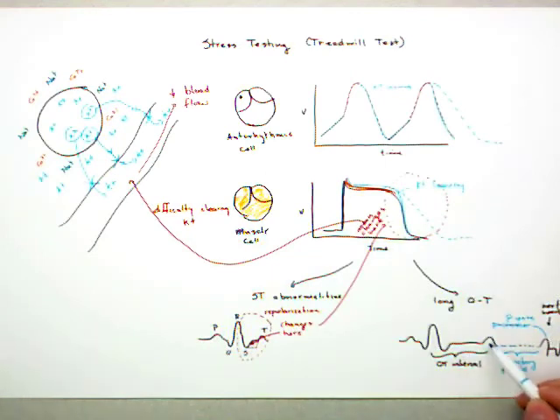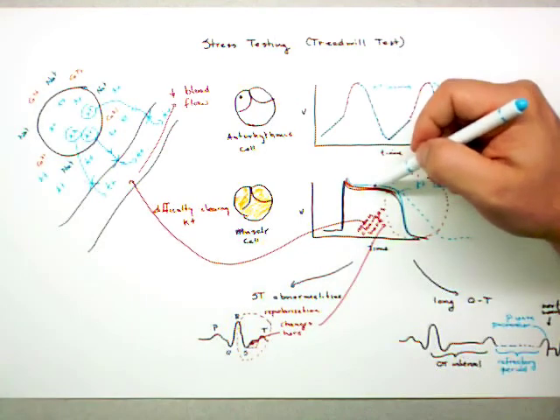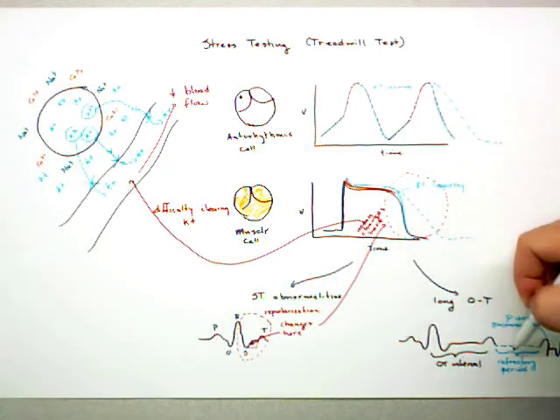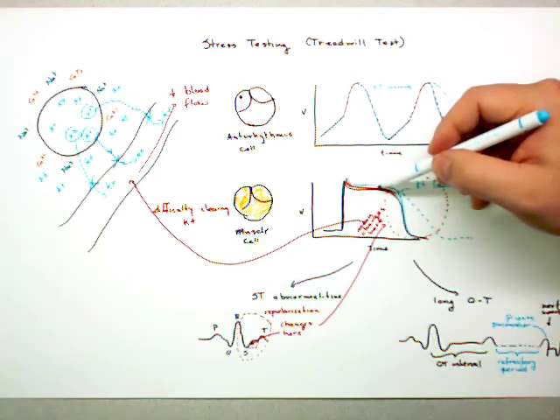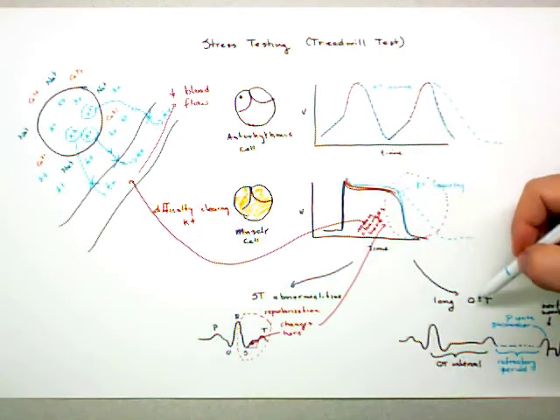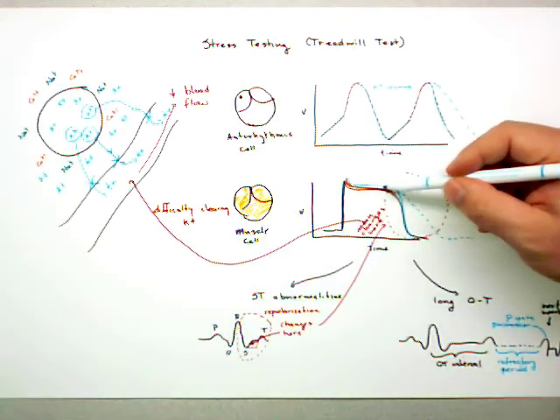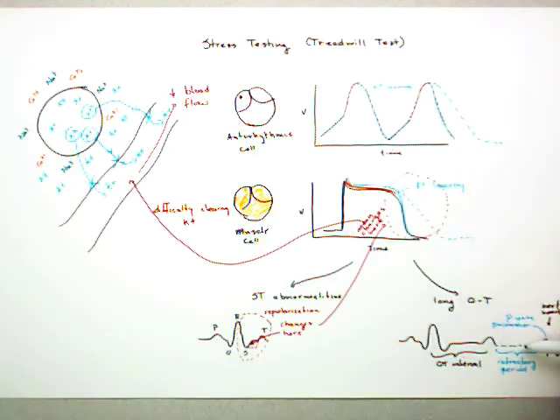Well, if this is delayed out too long, we've still got cells that are still depolarized. They haven't repolarized. So if you come out of this timeout and there are still cells elsewhere in the heart that are still depolarized, they will become the pacemaker. And that's a bad thing. So that's why often the QT interval is watched, because if the QT interval gets too long, it means there are cells that are staying depolarized. They might stay depolarized long enough through this timeout period that they actually take over for the atria, become the pacemaker of the heart.